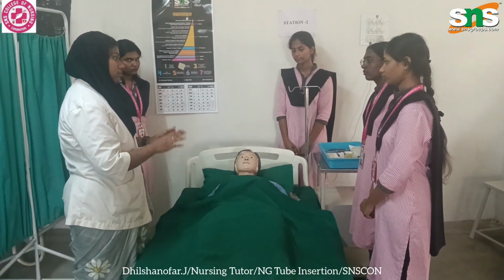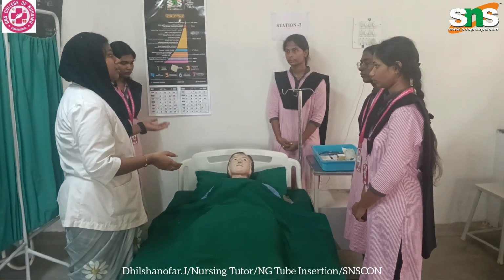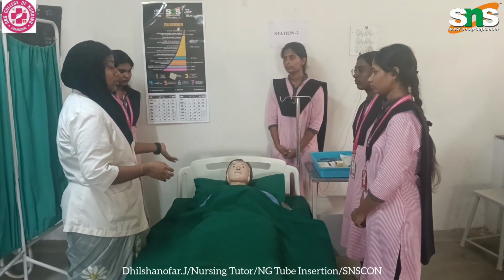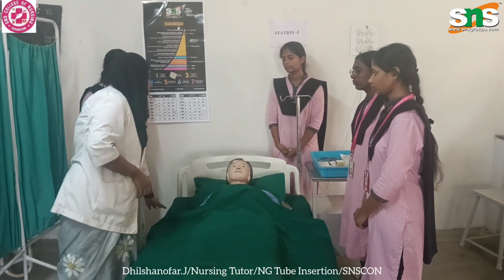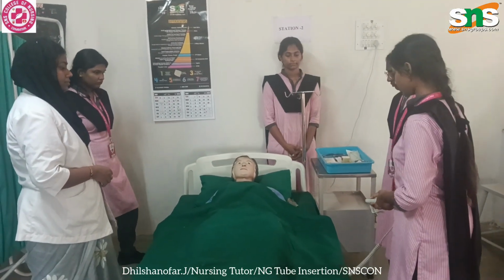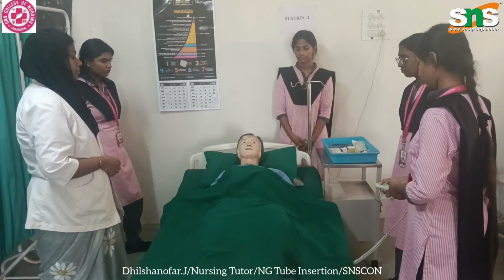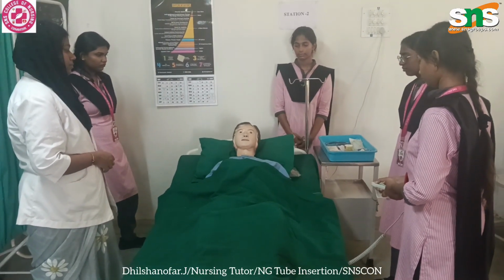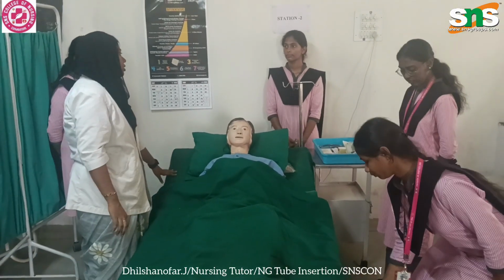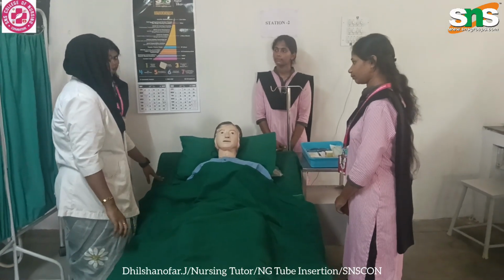If the patient is conscious or able to identify what is happening, make the patient sit or place in Fowler's position. So make the bed in Fowler's position. Fowler's position is where the patient should be in a 45-degree upright position.